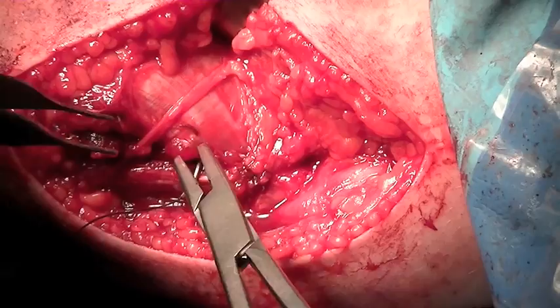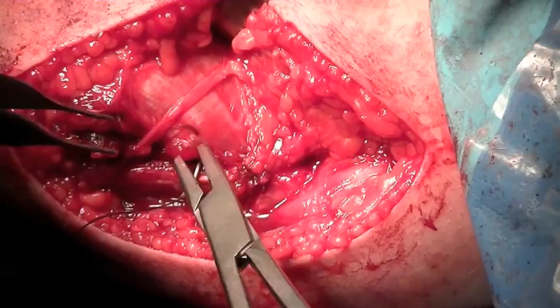The wound is then closed in layers after releasing the tourniquet and obtaining hemostasis. A long arm plaster splint is applied.